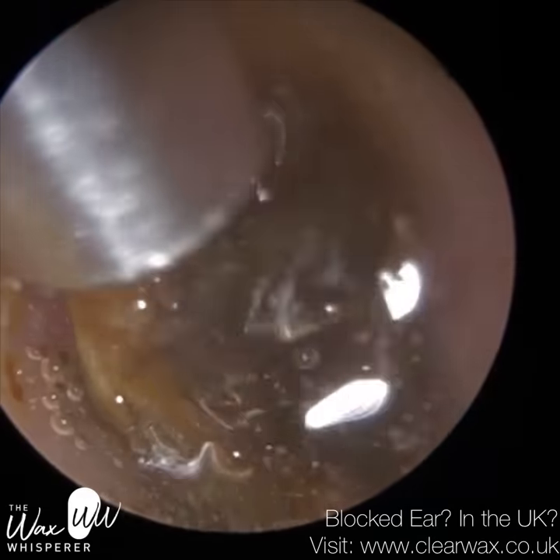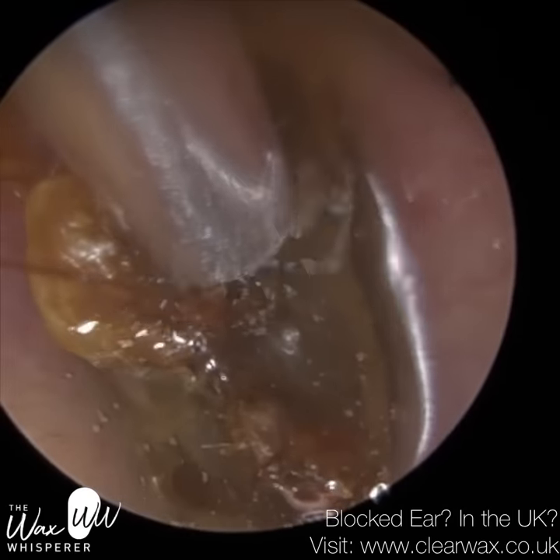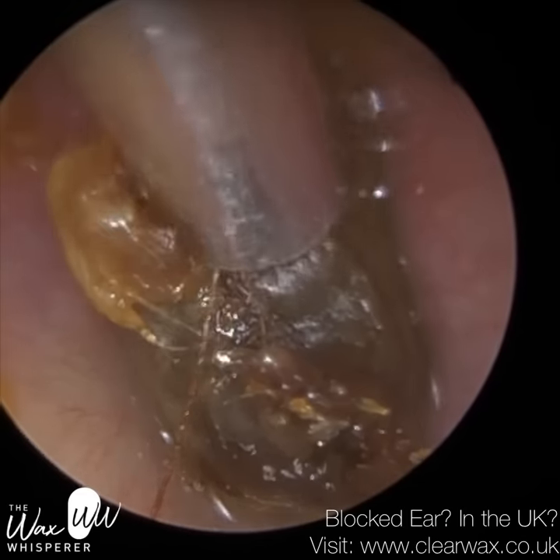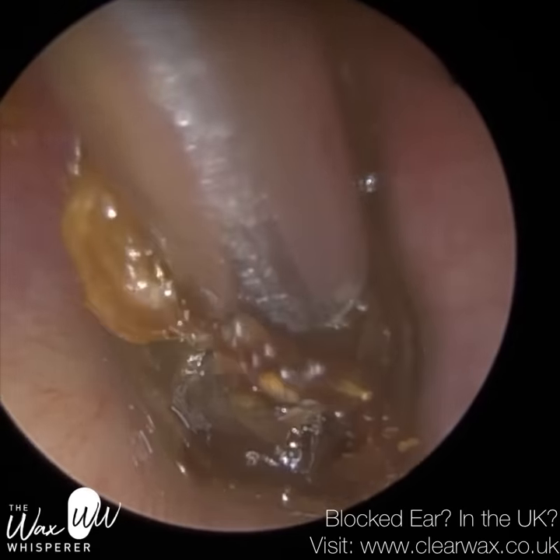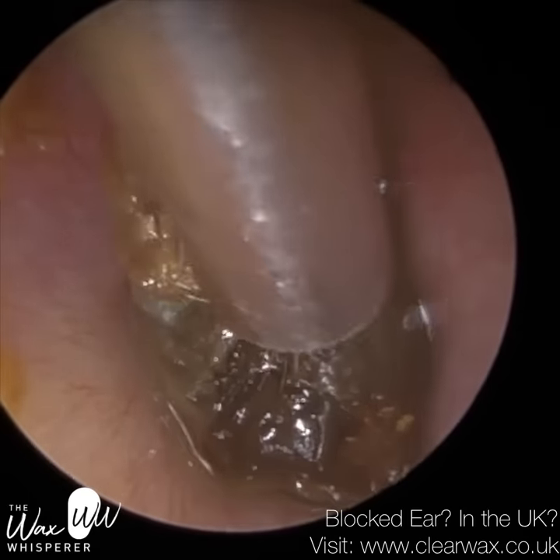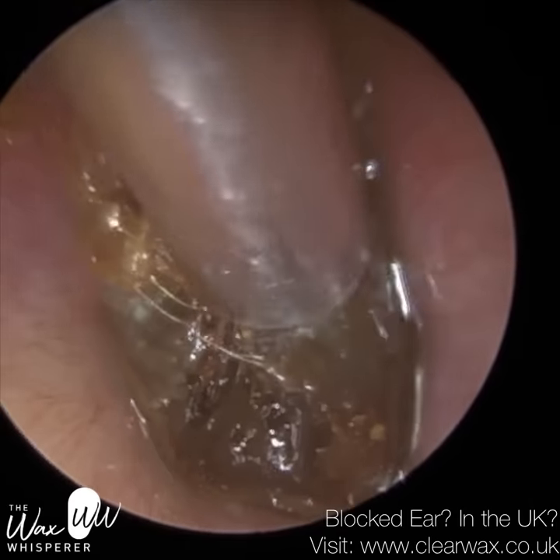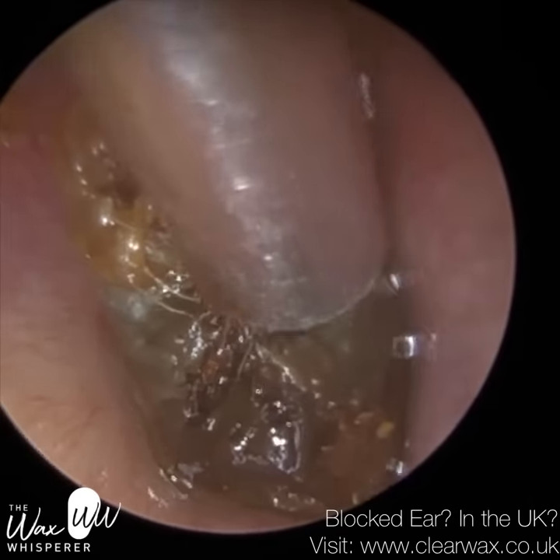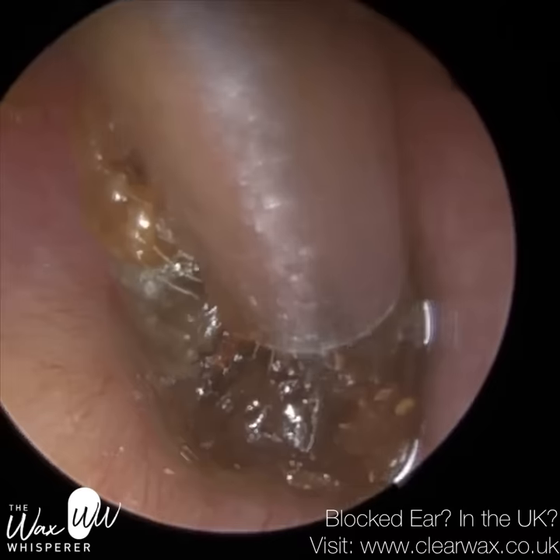With an endoscope, I still get depth perception, lots of surgeons do, that's why they do endoscopic ear surgery. You just rely on different cues. And one of the cues that I rely on for depth perception with an endoscope is the field of view. When you can see the whole ear canal and the landmarks and the shadows, and when you move the endoscope deeper in the ear and you can see the object in front of you magnifying, you look at the rate of speed of change. So when you're going towards an object and you're looking at that and the speed of the ear canal on the side, we call that motion parallax.